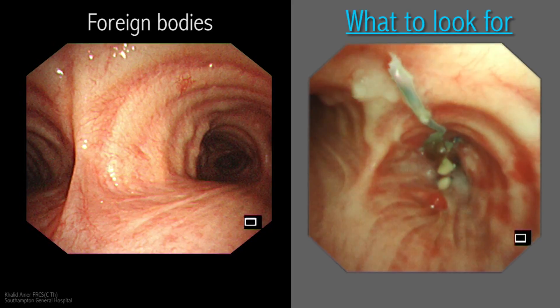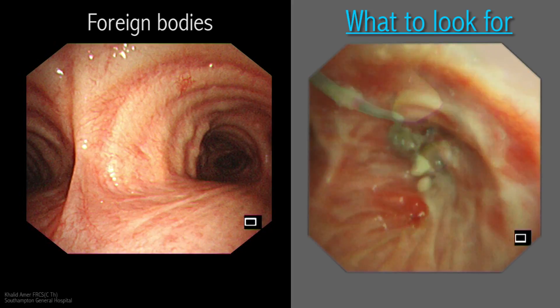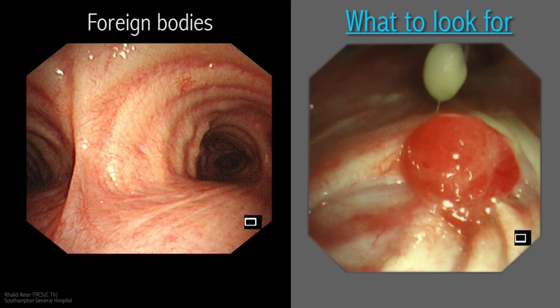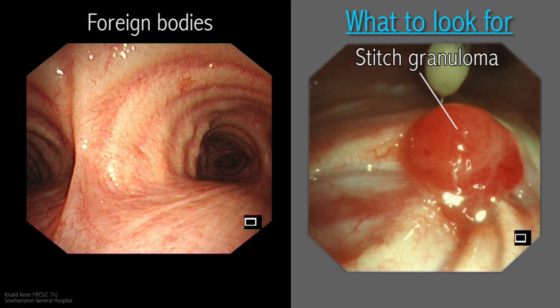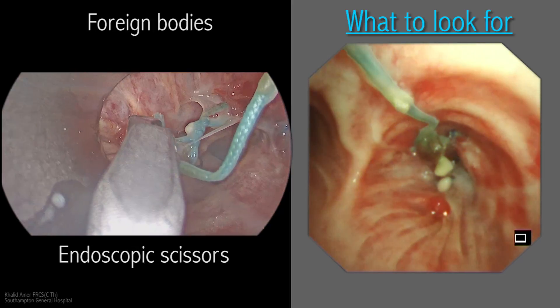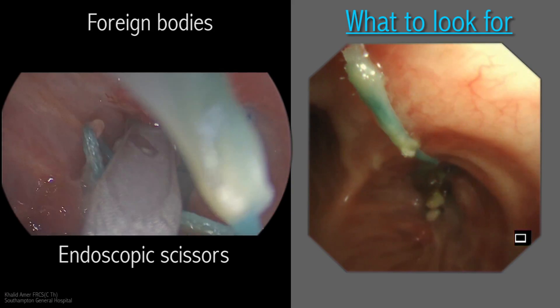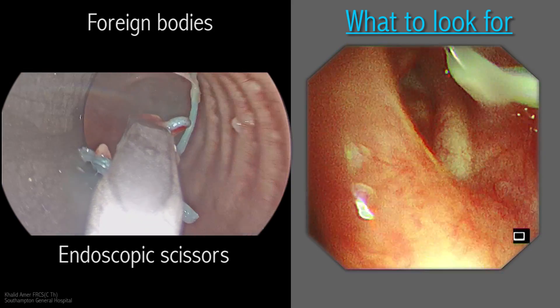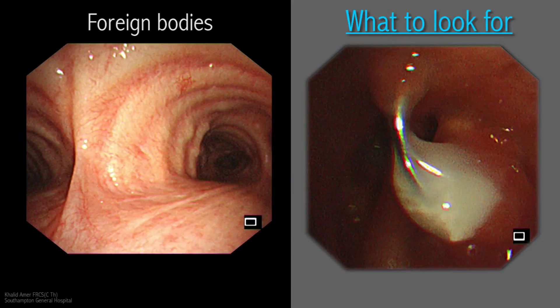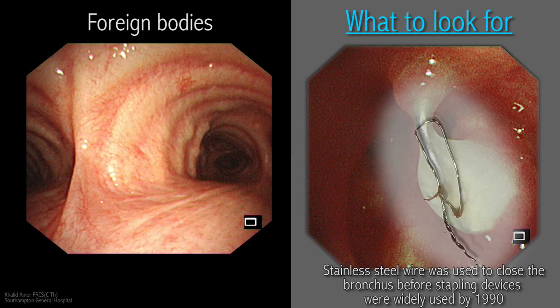An irritant cough following lung resection for cancer, sometimes accompanied by minor haemoptysis, does not always mean local recurrence. One of the benign reasons for this scenario is a stitch granuloma. If the bronchus was stitched at operation and not stapled, the patient might have a chronic granuloma on the stitches explaining the symptoms. This is likely to occur after bronchotomies and sleeve resections, especially if braided suture material such as Ethibond was used. In our unit, all sorts of suture materials were cut and removed endoscopically, including wire, which was used before stapling devices became popular by the 1990s.